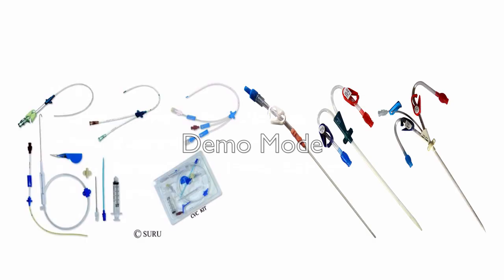Okay, and here we have different types of central lines. At the right side of the screen, these are the dialysis catheters. These have a larger diameter when you compare them to the left side of the screen, which shows the commonly used triple and double lumen central lines in ICU.